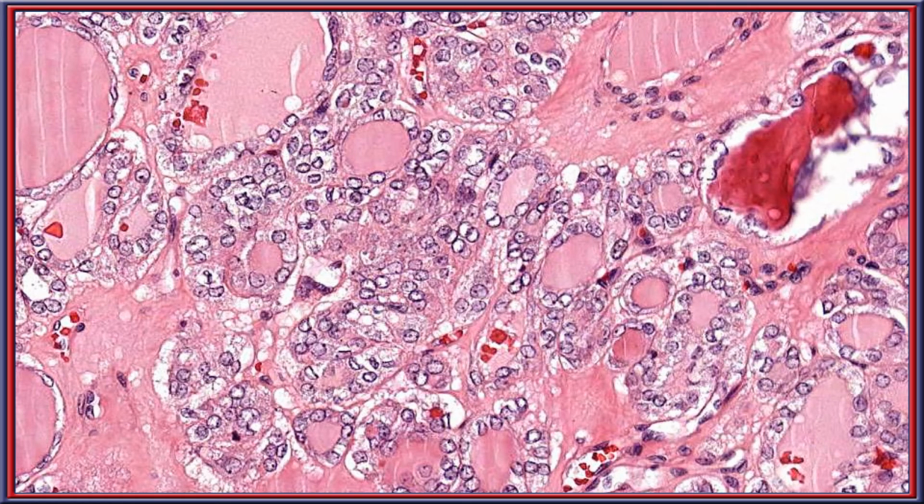So it is a finding that sometimes when you look at them, you can see that there are several different features that are present, and therefore it becomes easier to make the diagnosis. However, in a case in which you're struggling, if you just were to look at this and say, is there nuclear chromatin clearing, yes or no?